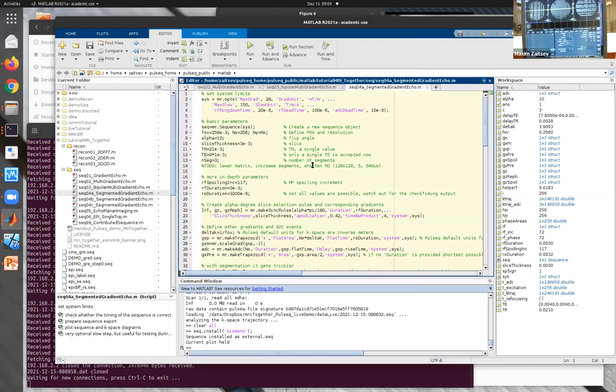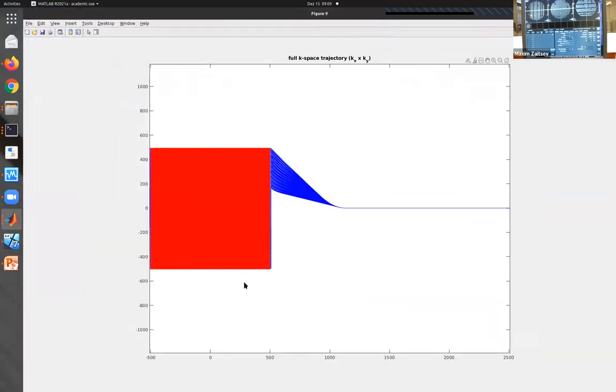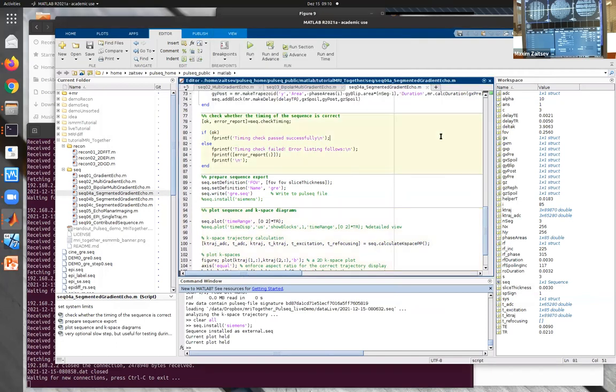So again, we're now phase encoding different segments differently. We can do that. And again, maybe in the interest of time, I skip the checking parts. You can see now something has changed because now we segment the sequence. We don't see much on this level, but if we zoom in, you can see. That's a little bit hard to see what's happening in the corner of k-space. We turn around and go back, because we now encode all these into the same k-space.